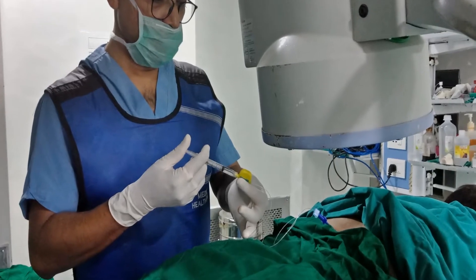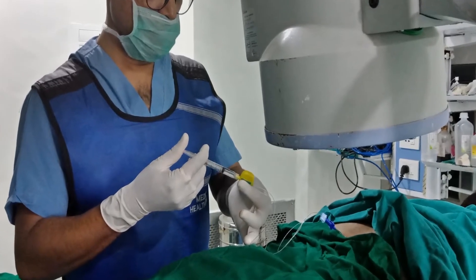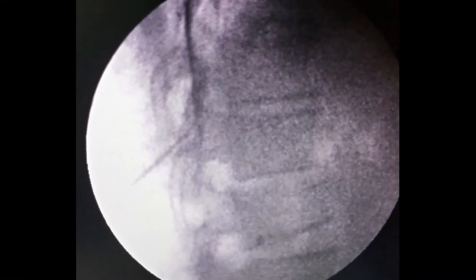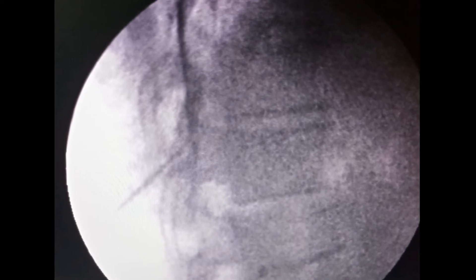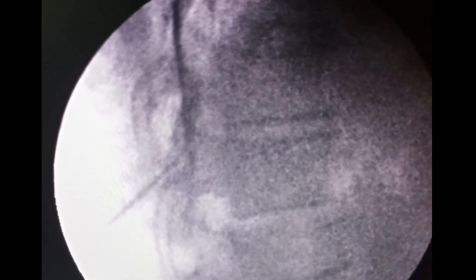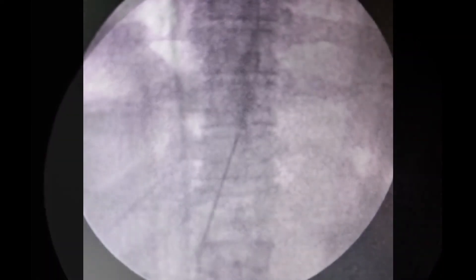Insert the catheter and confirm the dye in AP view and lateral view. You can see here the dye is spreading in the epidural space.